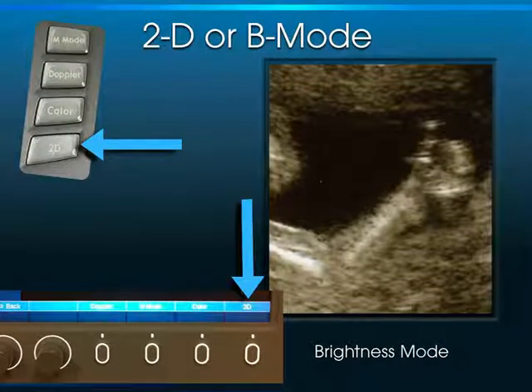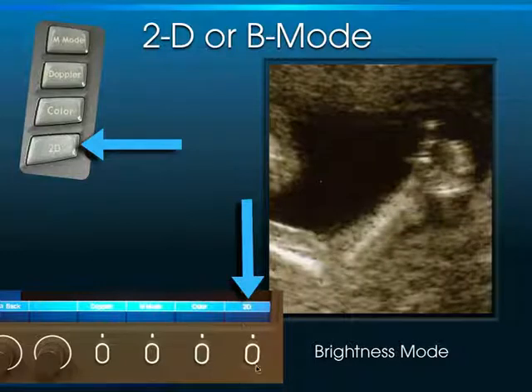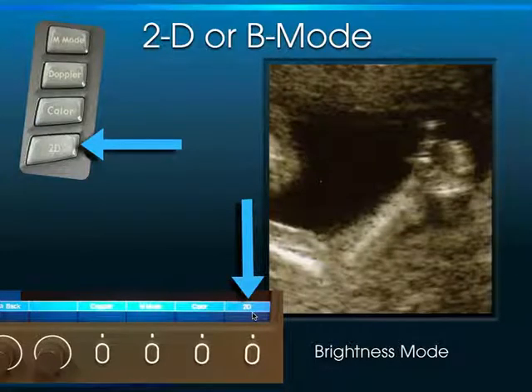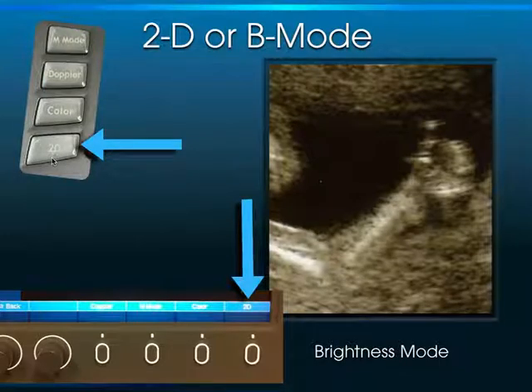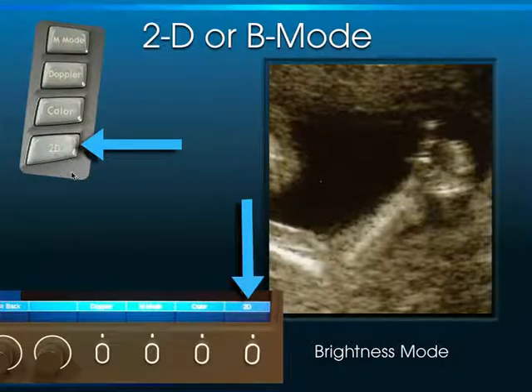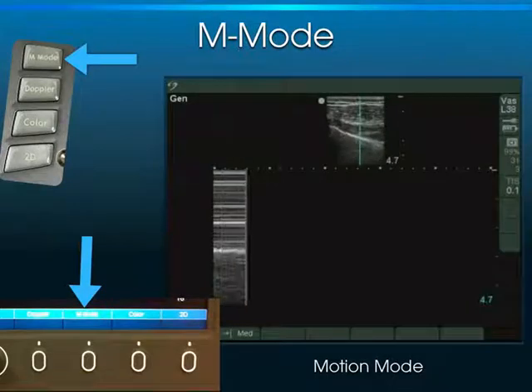Remember that with the Sonosight S machine, we have the 2D button, which is basically the brightness mode. It resets the whole ultrasound machine back to white dots on a black background. On other Sonosight products, like the turbo machines we have in the ER, the 2D button is in a slightly different location. Either way, 2D means reset the machine to brightness mode.